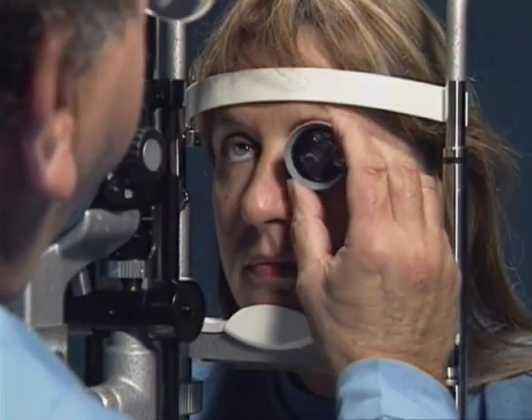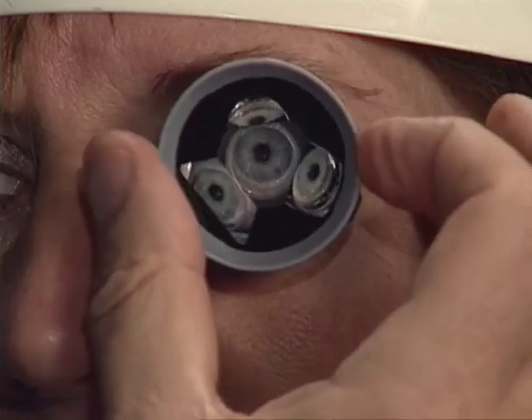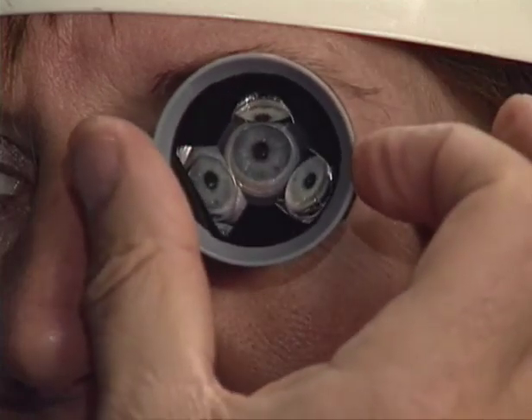Welcome to the examination of the chamber angle with the slit lamp. Introduction to the use of gonioscopic contact glasses. The purpose of this program is to familiarize you with the refinements of the examination of the chamber angle. To reach this goal, our video program is organized as follows.